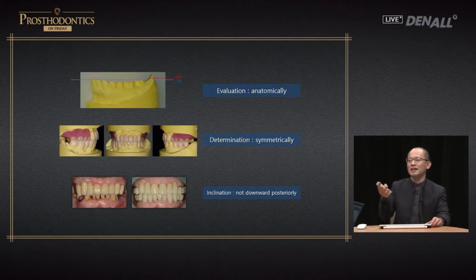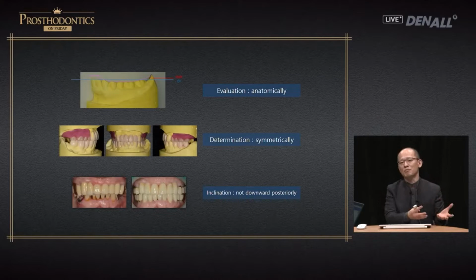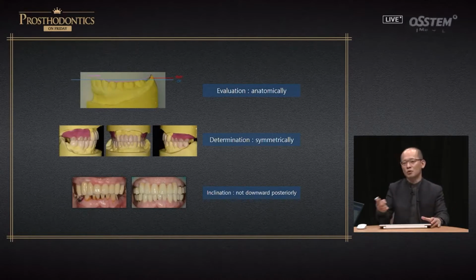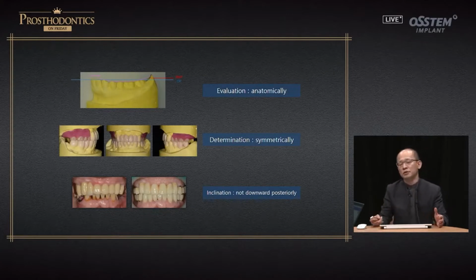So you just let what is already there be. If the VD is increased, then on the posterior it goes a bit lower. Then on the posterior side you have to always adjust. Otherwise, you have a lot of porcelain fractures. If you see the bottom image, you have all the fractures, and on the posterior there's an implant, so you have to watch out for that.